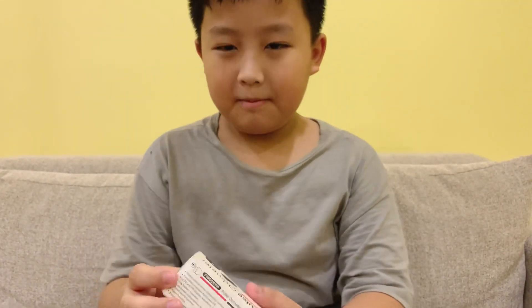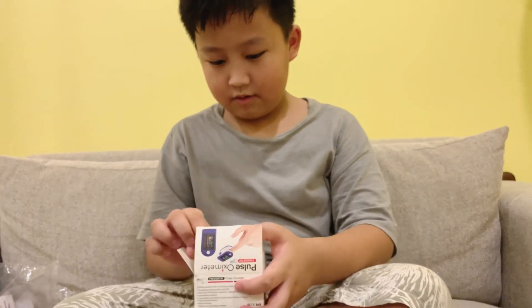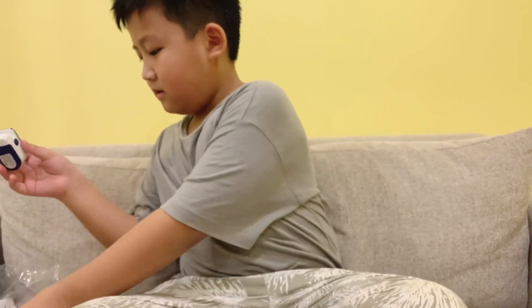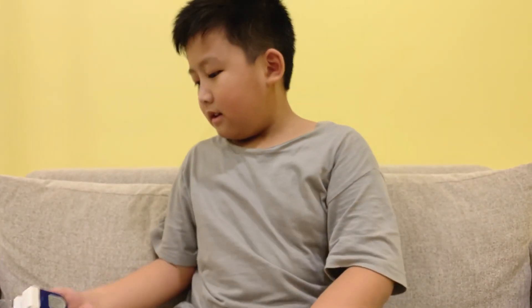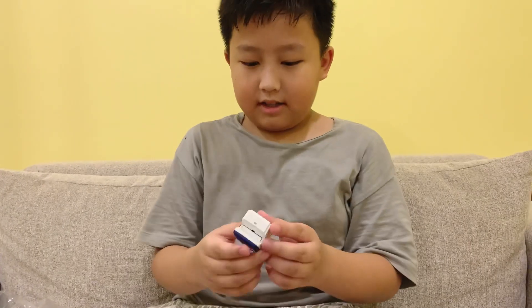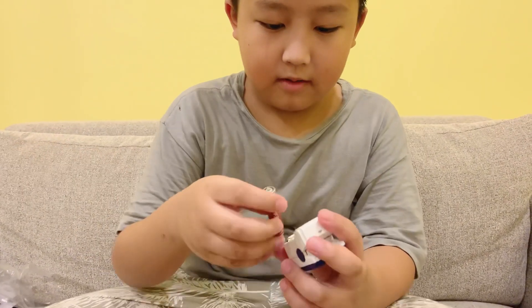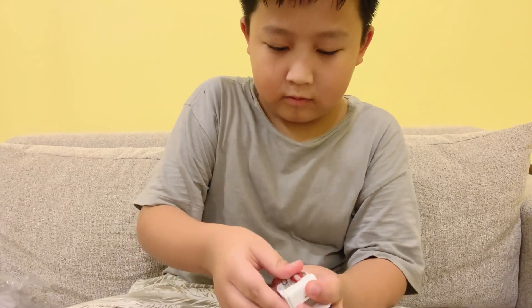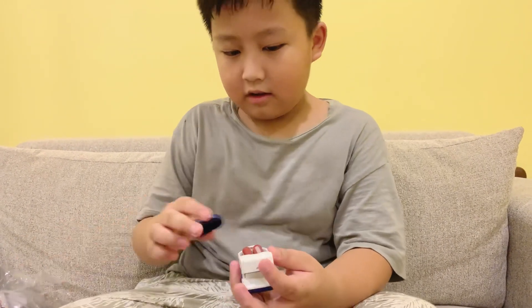Moving on, we have the pulse oximeter. Let's unbox it, shall we. Oh, what is this also inside? Some kind of hanging strap. It doesn't work yet because it doesn't have any batteries — so here's the first battery. Let's close it.